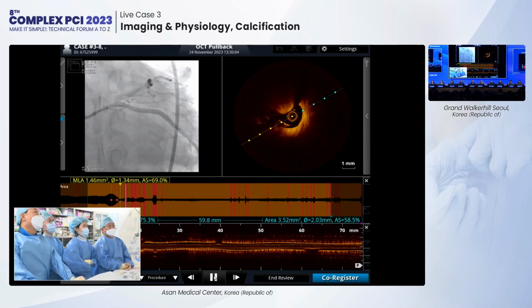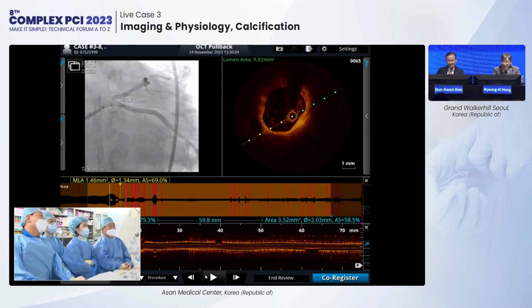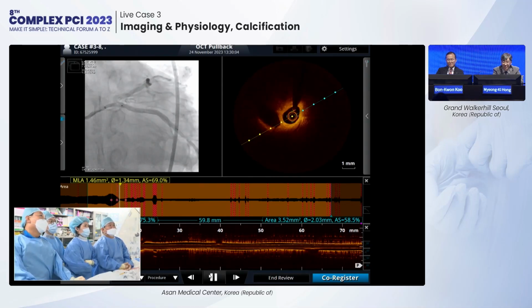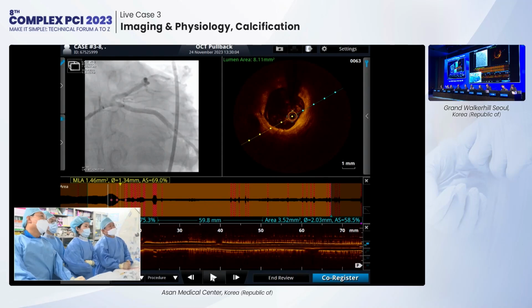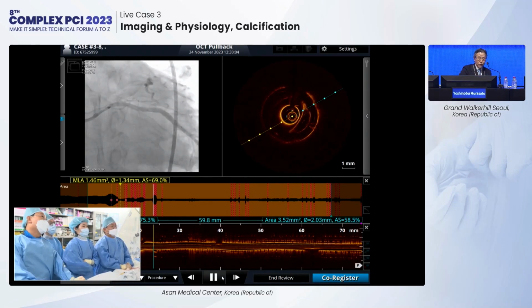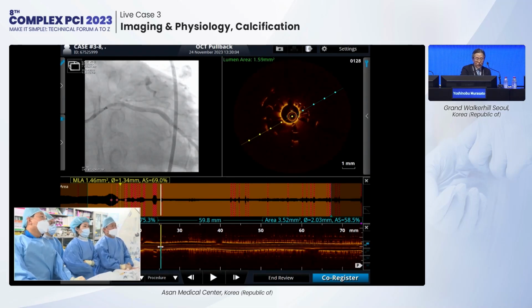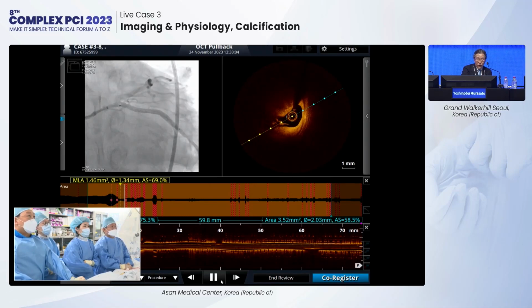Actual lumen blood clearing is not perfect. It may artificially create, maybe, a calcified nodule extended from 10 or 12 o'clock. So, a large calcified nodule. And at 5 o'clock and 7 o'clock, there is a lumen connected to the proximal side. So, a flattened lumen here, it's connected. Yeah, right.